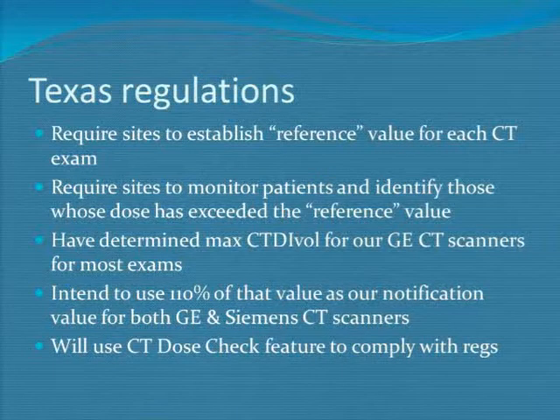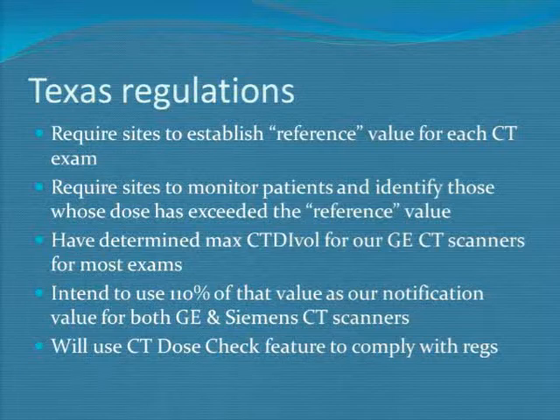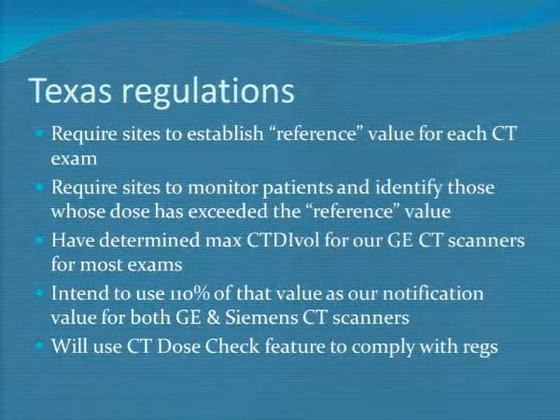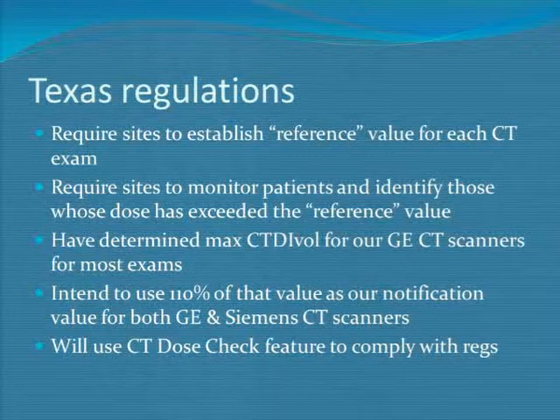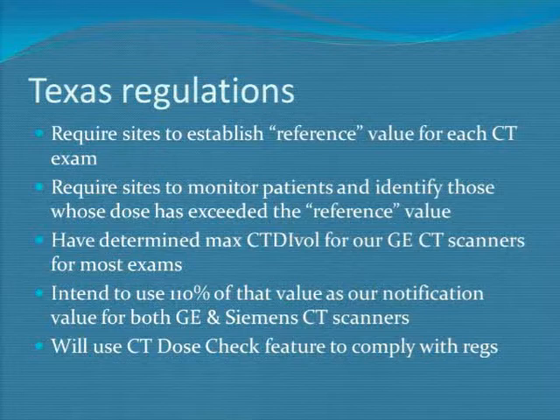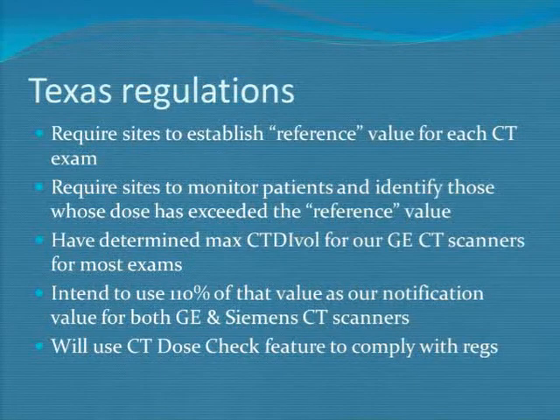But we're planning to do the audit once a month to start with, and as things start to be a little more comfortable, we'll probably push that off to once a quarter and maybe further. And this is, for me, sort of a temporary measure until we get dose tracking software installed and running. They tend to have better tools than this to do what the Texas regulations really want us to do. And so I'm hoping eventually to move this into that kind of a program.